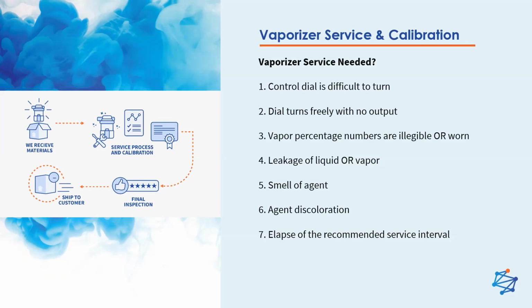vaporizer service recalibration. This service is more complex and can only be conducted in a laboratory controlled environment. The vaporizer is disassembled, replacing all the wetted parts, including the seals, gaskets, and wick, and then thoroughly inspected and rebuilt as new. Lastly, the vaporizer is calibrated using a laser refractometer, which is the gold standard in vaporization calibration and used in human anesthesia. Performing anesthesia services as outlined will ensure clinical accuracy, operative and patient safety, and maintaining study validation.